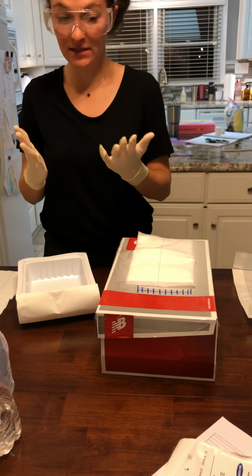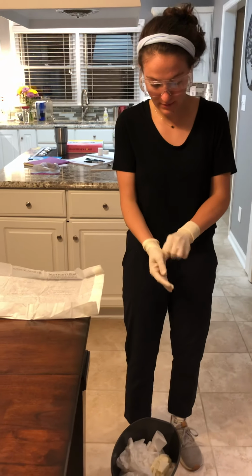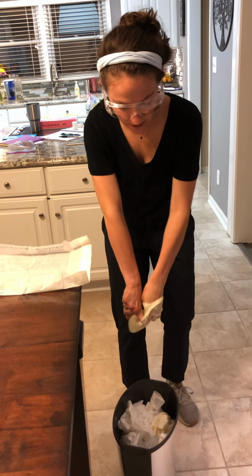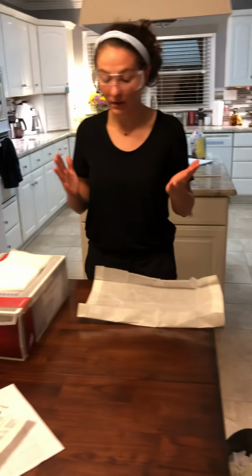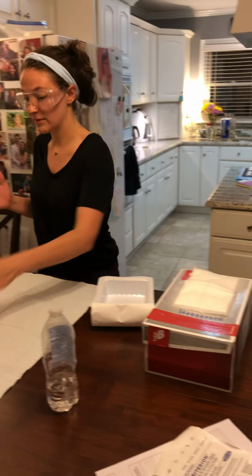Okay, and now I'm going to take off my sterile gloves. Careful to not splash and keep my hands toward the trash can. Okay. Now I'm going to secure the area with tape.